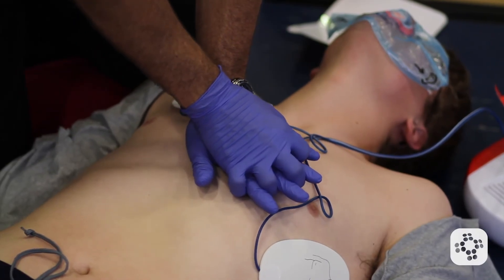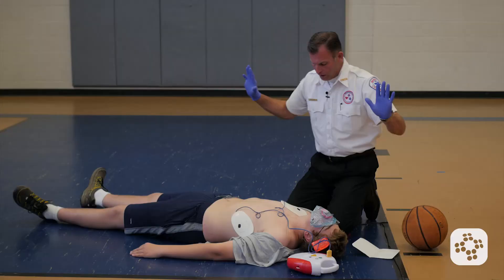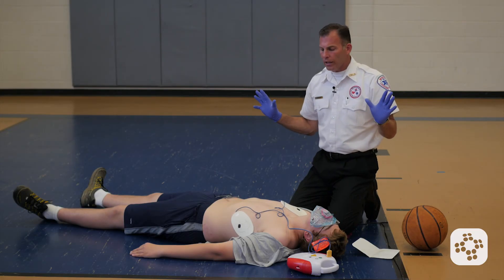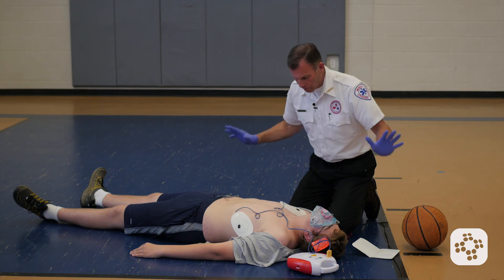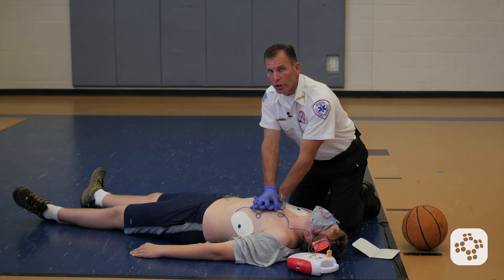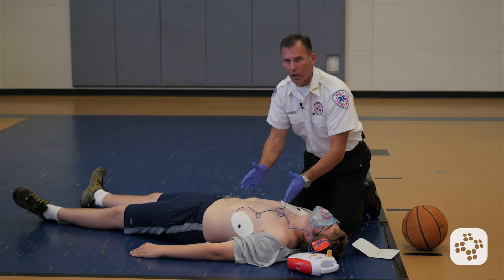Followed by 30 more compressions. The AED is analyzing rhythm again — everyone stand clear. When it interrupts, we stand clear and let it analyze for a rhythm. No shock advised. Begin five cycles of CPR. So whether it says a shock is advised and recharges so you can shock, or whether it says no shock advised, we're going to follow its prompts and go right back into whatever it tells us to do.